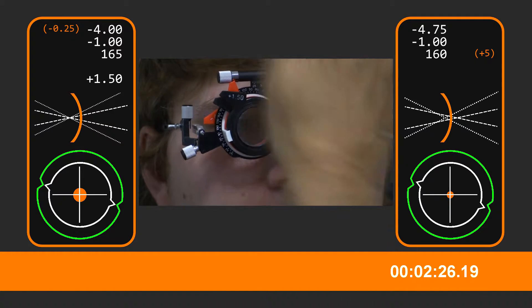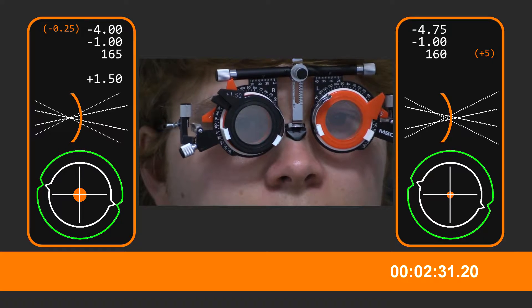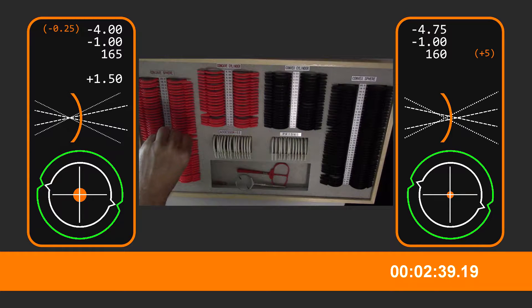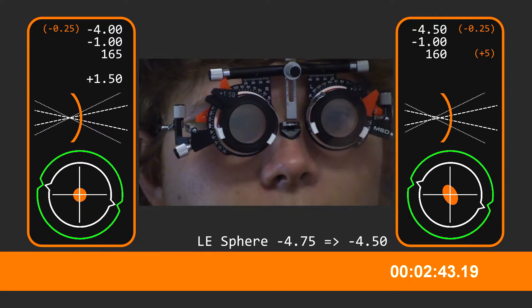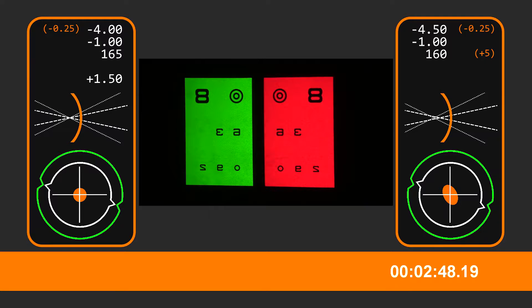Now I'm just going to go over to the left eye. Let's have a look at those circles there. Which ones do you think are clearest and sharpest? Green slightly. What about red? I can't really tell. I'd say red, yeah. Red a bit, yeah.